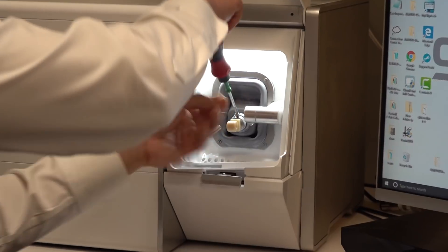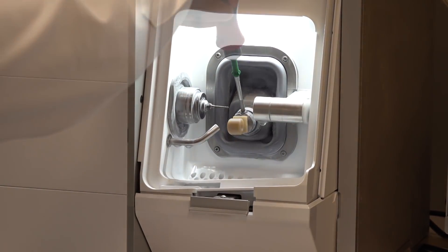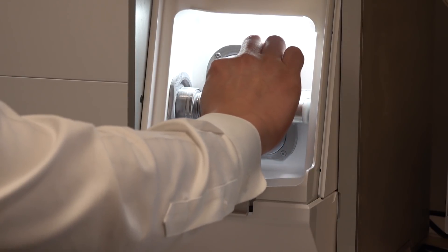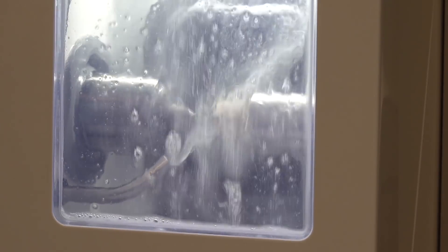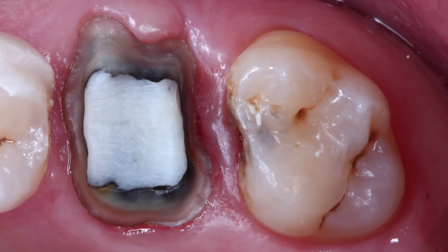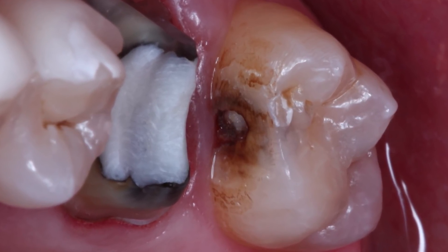After five minutes when the design is complete, I'll load a Bruxer block and diamond burr into the FastMill. While these crowns mill, it's a great opportunity to work on any other procedures the patient may need. In this case, I'll remove and restore the cavity on the mesial of the upper second molar. With the tooth prepped away on number 14, I have clear access to approach this class II lesion from the mesial.